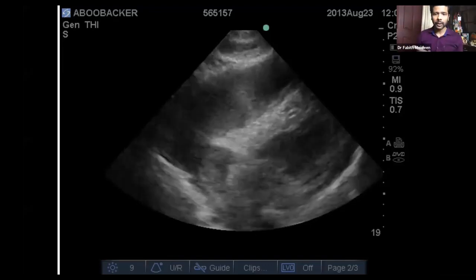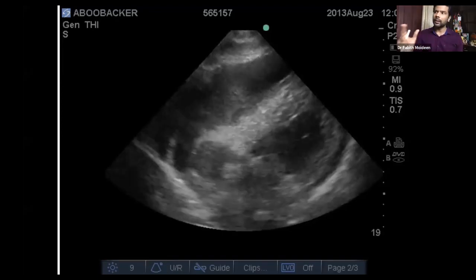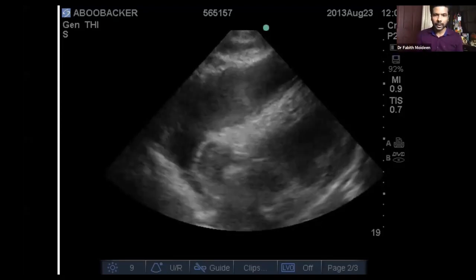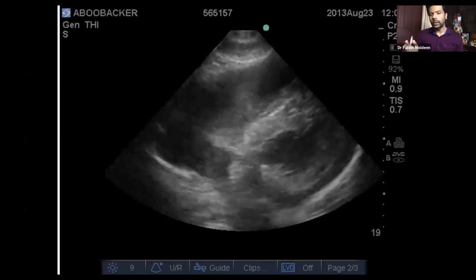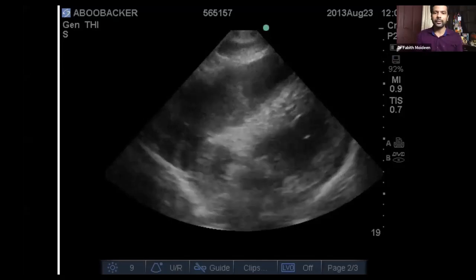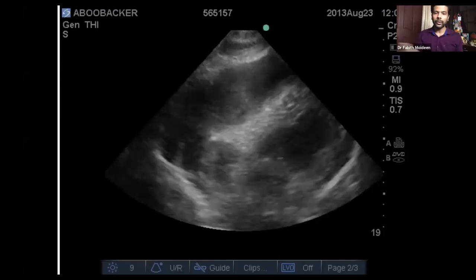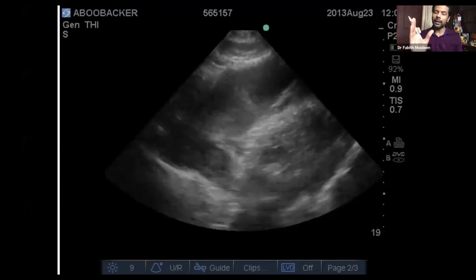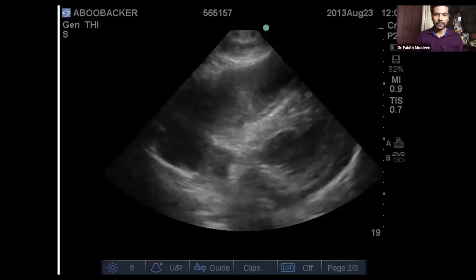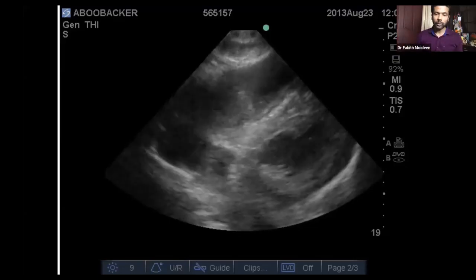If you find a patient with cardiac arrest and the heart is standstill, and the patient has multiple comorbidities, especially in this time with a COVID patient, I don't recommend aggressive resuscitation. It doesn't make any sense, you will not get them back, and you will be exposing many people. Otherwise also, if you have a cardiac arrest and the heart is standstill, it's very difficult. The literature says the chance of survival is very low, and neurological outcomes are going to be extremely bad. That is one thing you have to keep in mind.